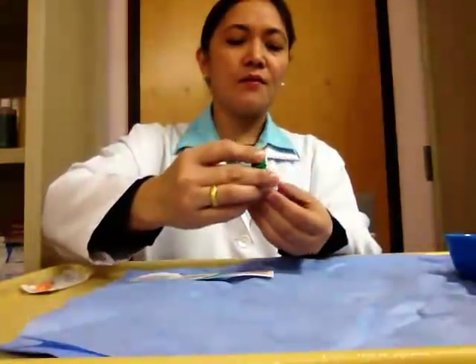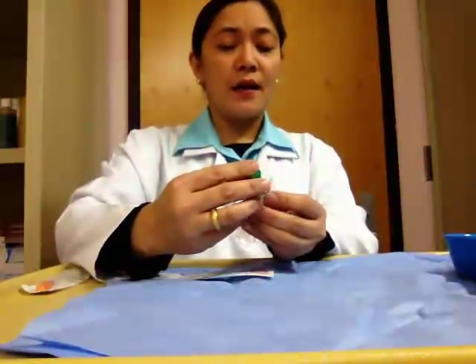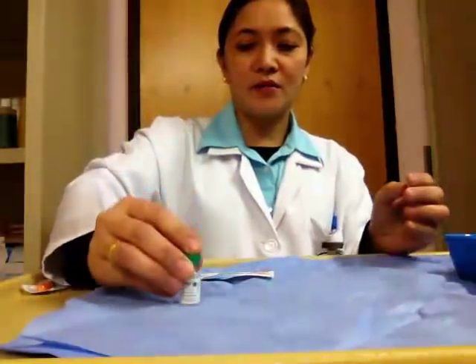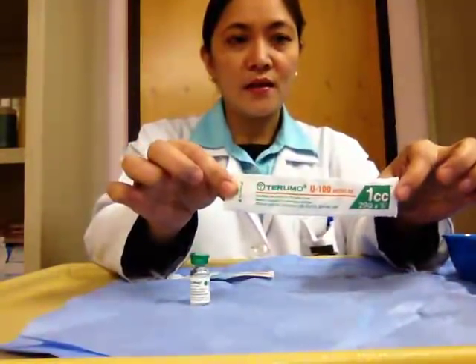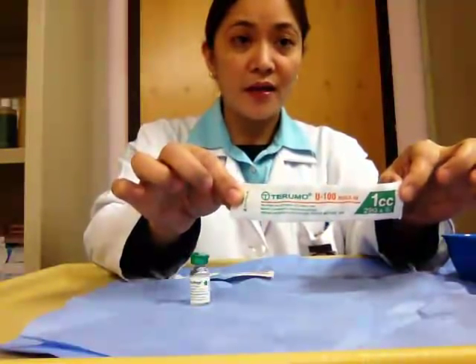I'm going to prepare medication to be given subcutaneously. The most common medication that is given subcutaneously is insulin. So we have to prepare our insulin, read the label to check whether it is the insulin that you need, check the expiration date, and check the cloudiness of the medication so it's still okay. And of course, we need an insulin syringe. This is a 1 cc syringe with an attached needle, gauge 29, a very fine needle.